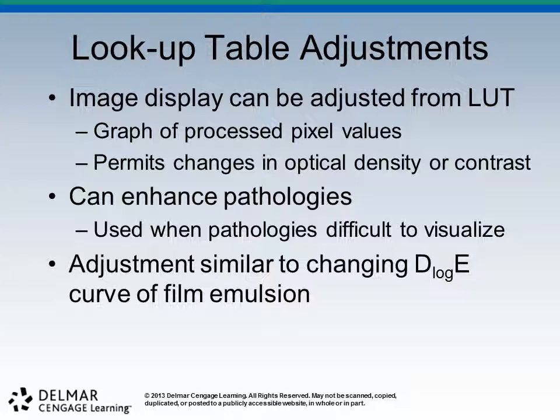It can just about get individual pixel size of increased or decreased attenuation. If we give it the opportunity, it will enhance or make more visible pathologies and other things that otherwise we wouldn't have even seen, even on a piece of film.